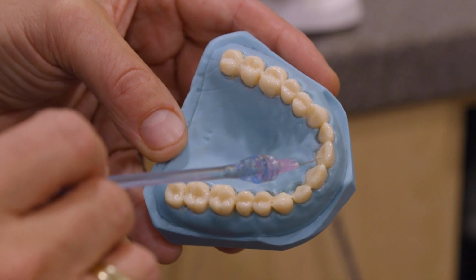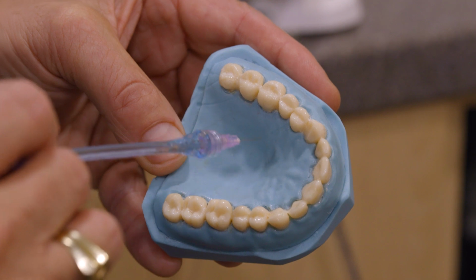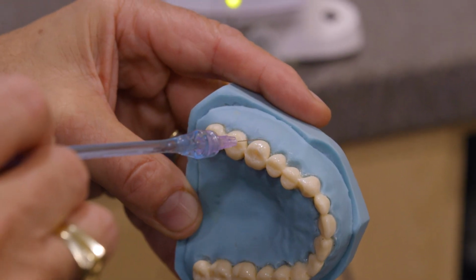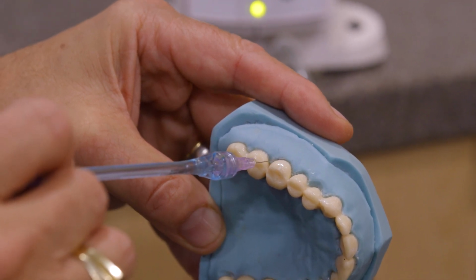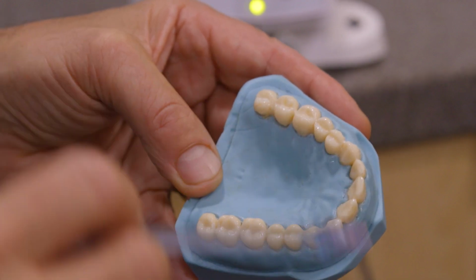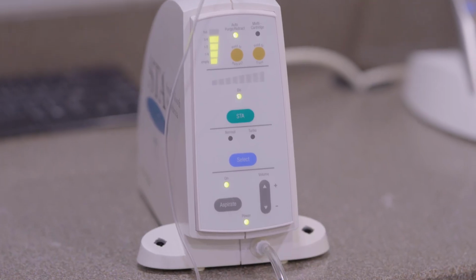that arch. To complete the anesthetic on that molar, if the AMSA does not create enough anesthetic, we will give a little PDL on the distal buccal of the molar to complete the anesthetic, at which time we can then perform any dental procedure that we like.